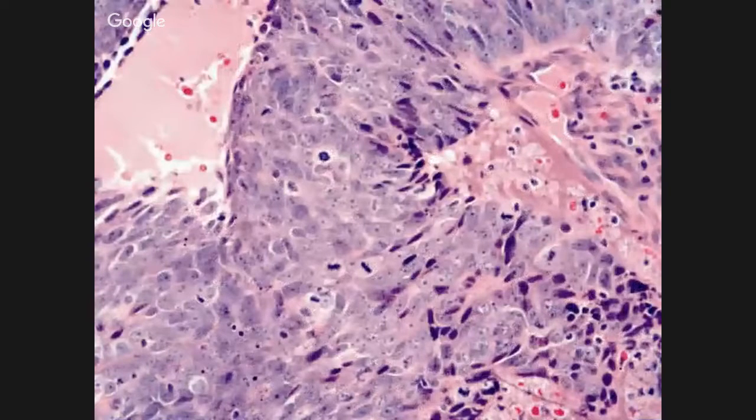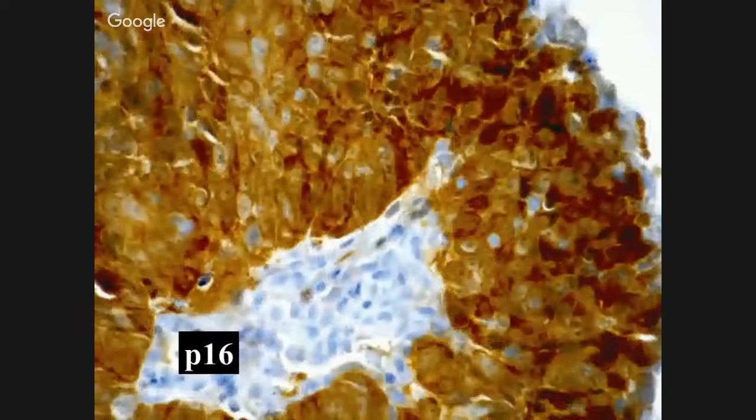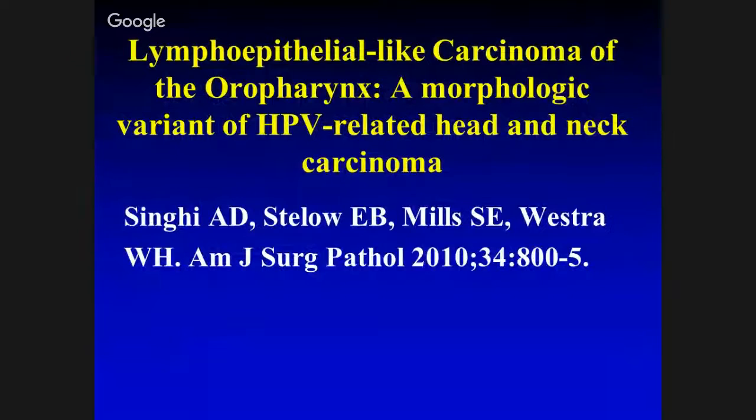Patient with metastatic cancer of unknown primary. You look at the morphology, the mitoses. It has similar morphology to non-keratinizing carcinoma. But it was EBV negative and P16 positive. So just to show you, as we finish up, that you can get cancers in the neck that are morphologically identical as EBV and HPV. So we need to do both stains.